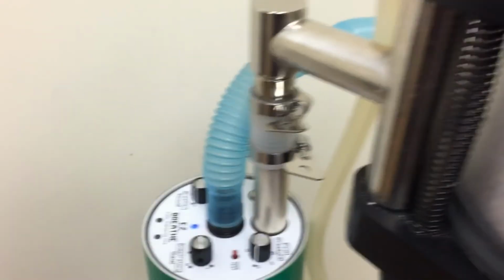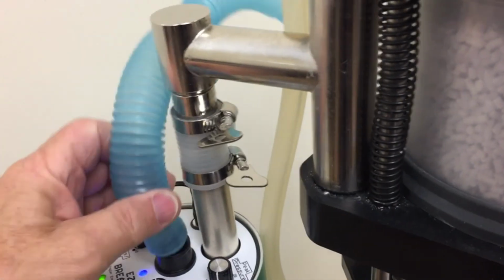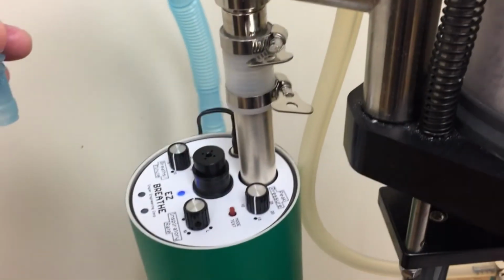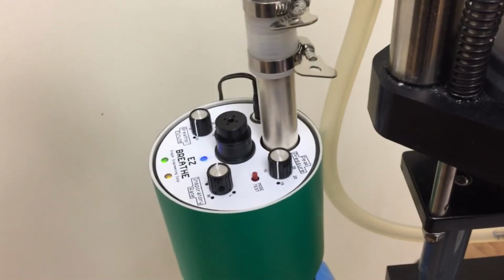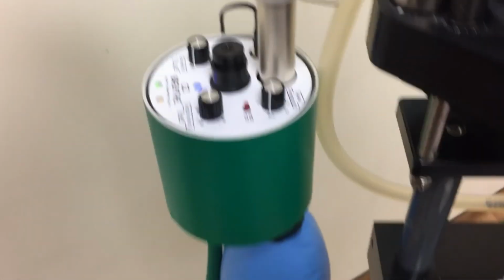One way to tell if the scavenger is the problem is to remove the active scavenger and use an F-air canister or other canister and see if that corrects the problem.